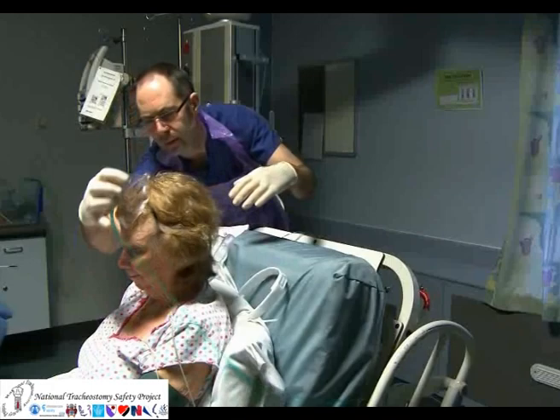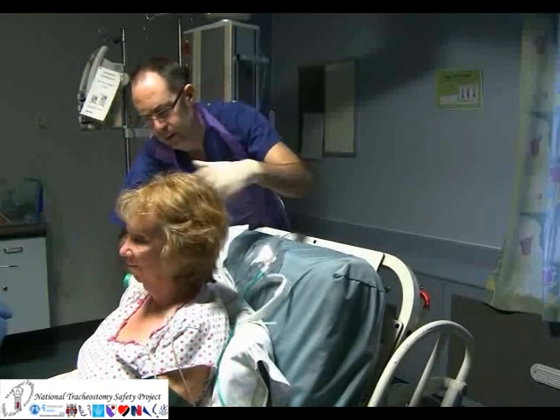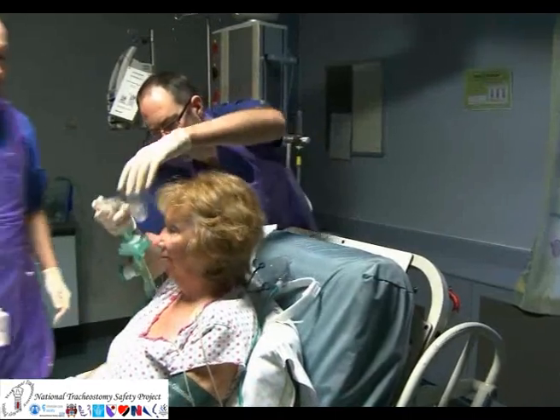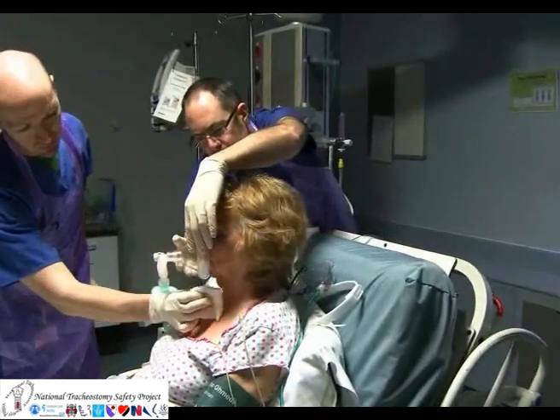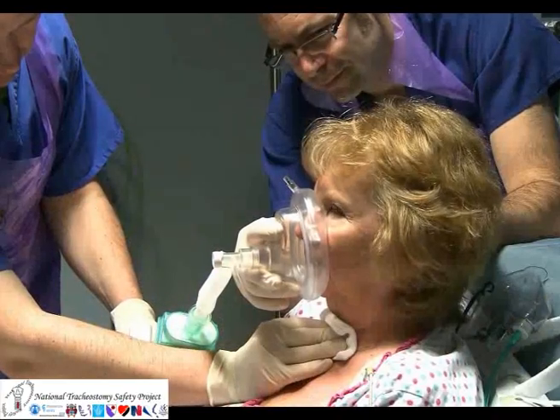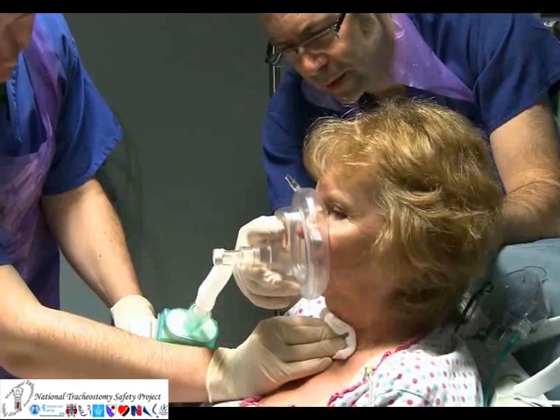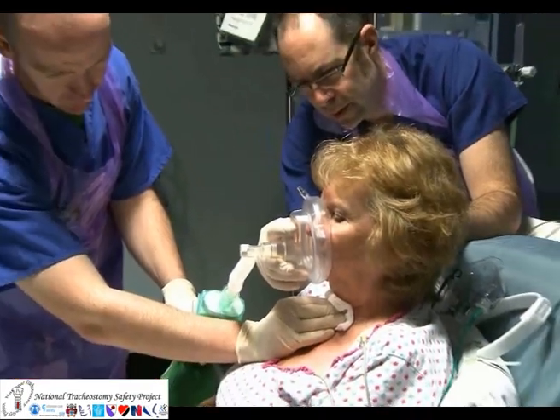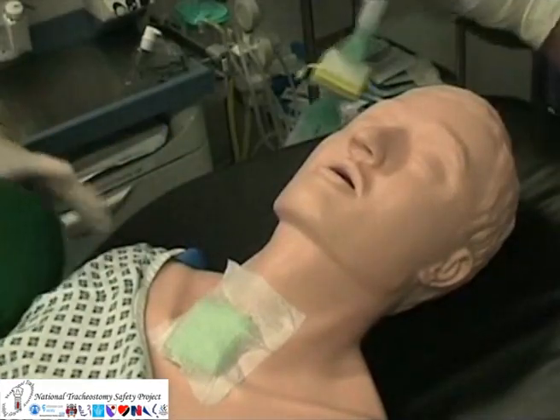Following removal of the tracheostomy tube, primary emergency oxygenation can be achieved by using basic oral airway manoeuvres. We must remember to cover the tracheostomy stoma to facilitate this.